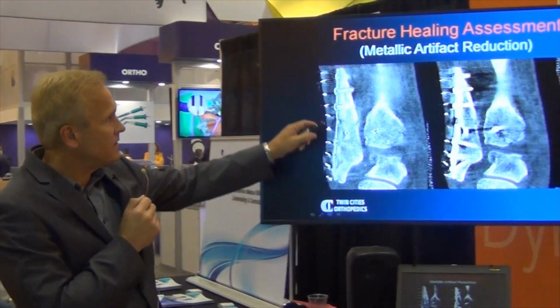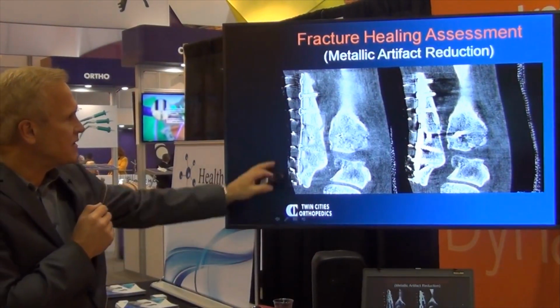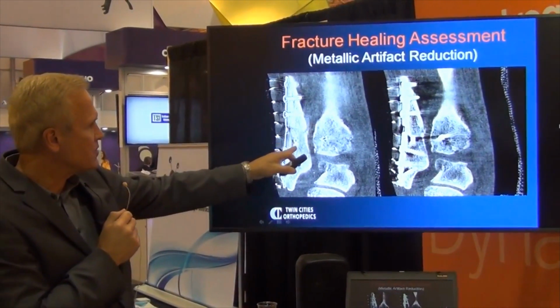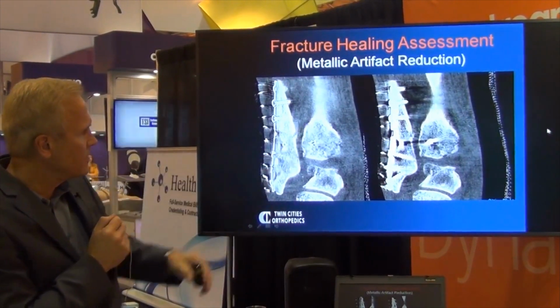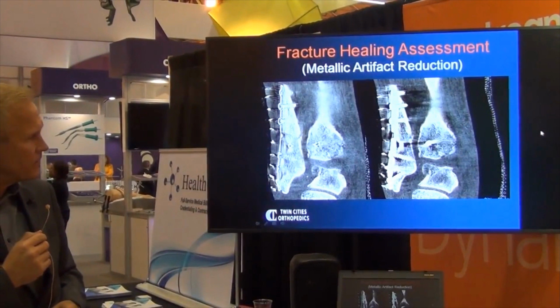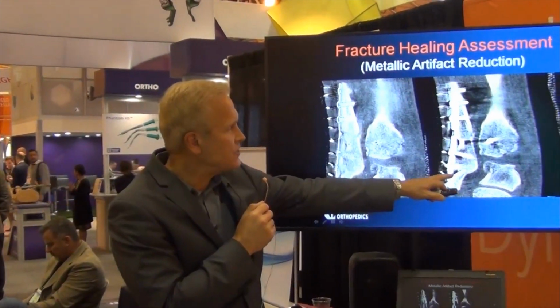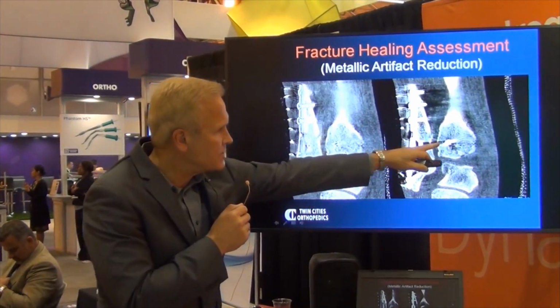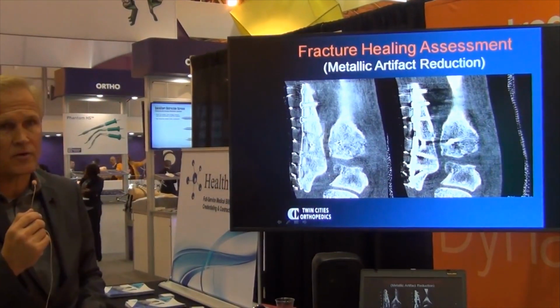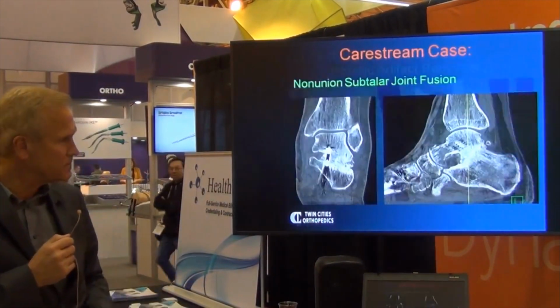So here's a little example of the metallic artifact reduction that I'm seeing. You can see that basically the software negates all the hardware in the areas of the fracture, so you get a better evaluation of whether or not there's a connection across the fracture sites. You can do the same thing with fusion, as I'll show you a little bit later. But you can see the scatter that you get with a regular CT scan, the blackness that occurs there, the shielding of the X-ray by some of the hardware. So this is a much more consistent view of what's going on inside the bone.